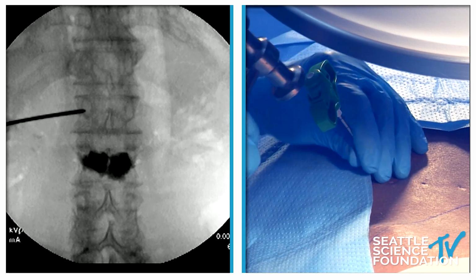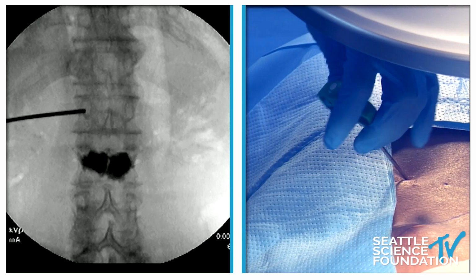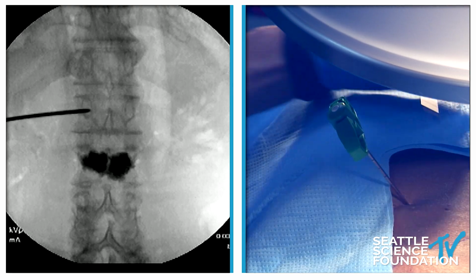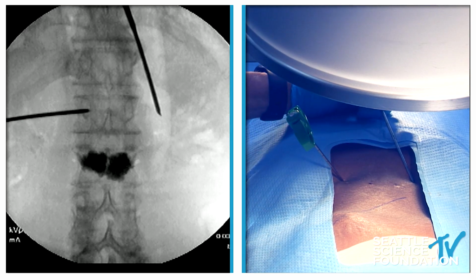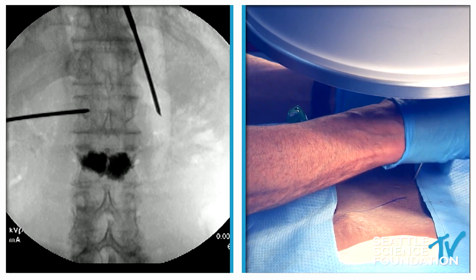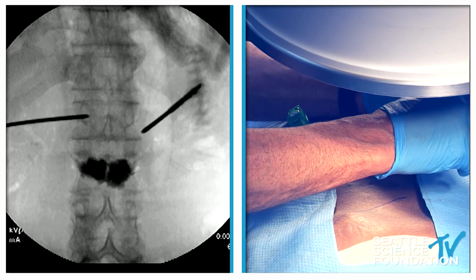So we're going to advance this transpedicular approach, a very flat approach, and I'm going to try to get toward the medial portion of the vertebral body. I'm going to start here, and then for time's sake, I'm just going to go ahead and start on the other side so we can go lateral one time. So Doug, the difference between these two devices: a balloon device, which gives circumferential elevation and expansion, and the directional SpineJack, which gives mechanical instead of hydraulic elevation.